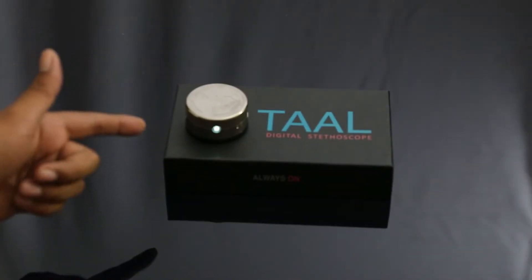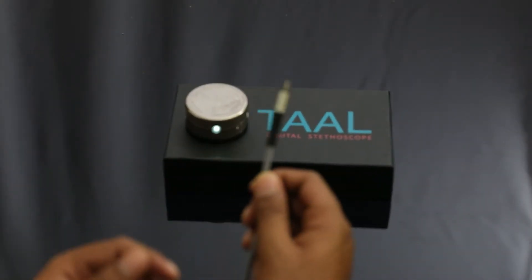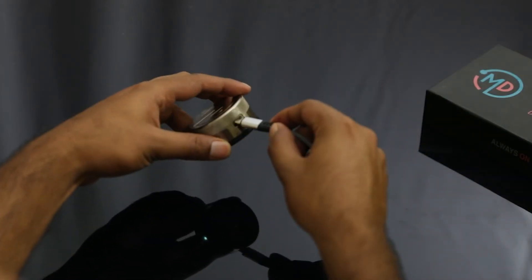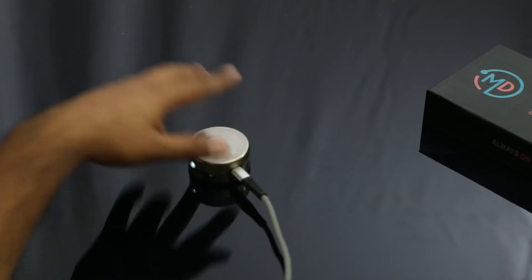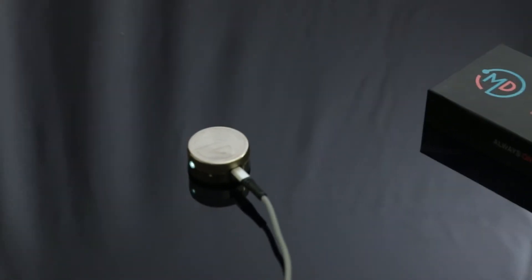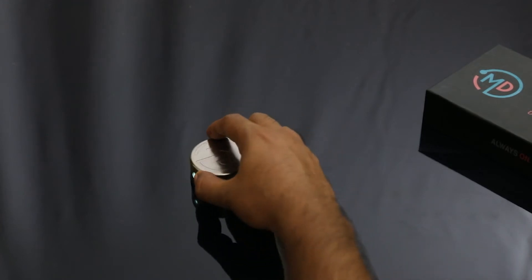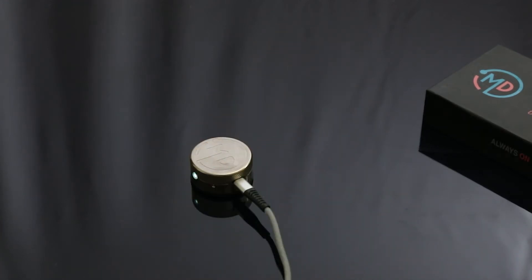The first thing you want to do is take the USB-C cord that is provided with the box and connect it to the Tal Digital Stethoscope. Wait for the indicator to turn green or blue. This will take about 6 hours on the first charge and 15 minutes on subsequent charges.